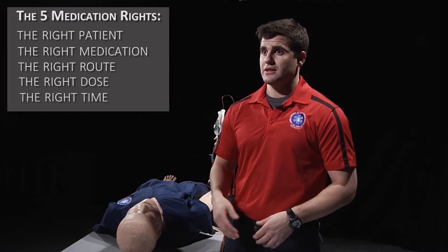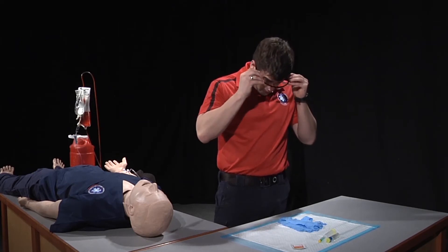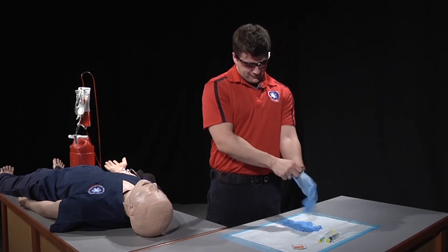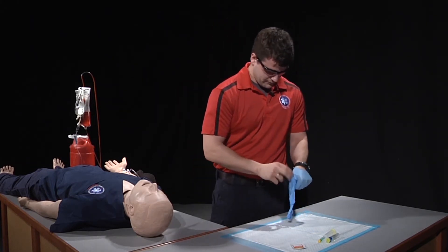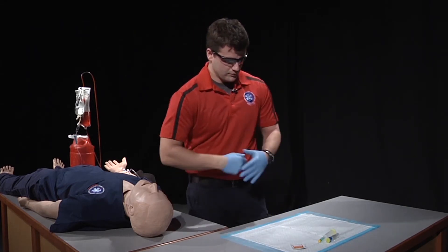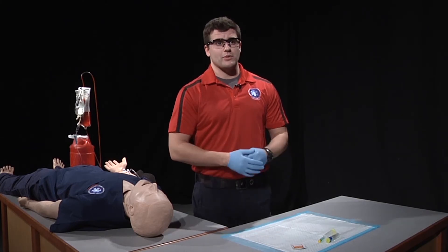After you've confirmed these, we need to put on the appropriate PPE. Once our appropriate PPE is on, we need to put together our pre-filled syringe.